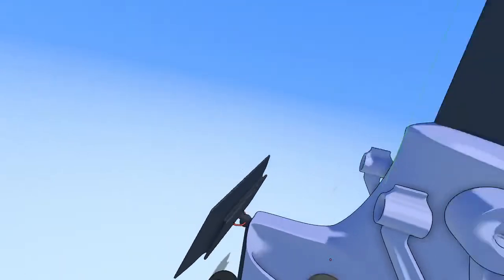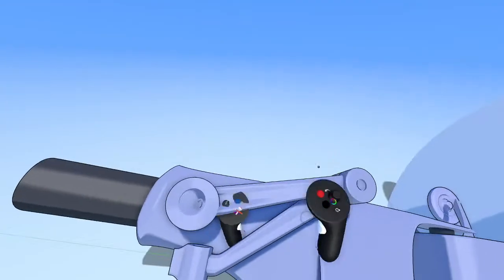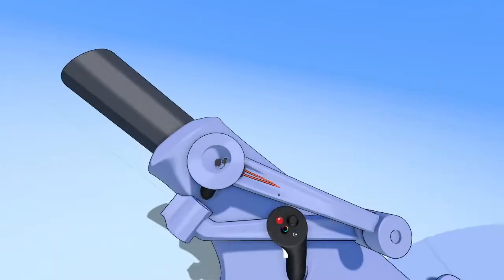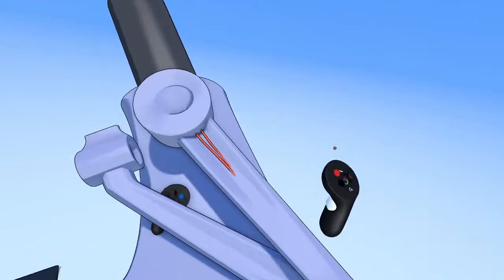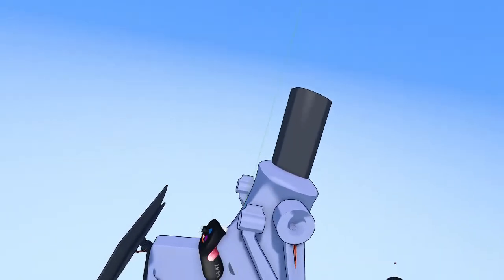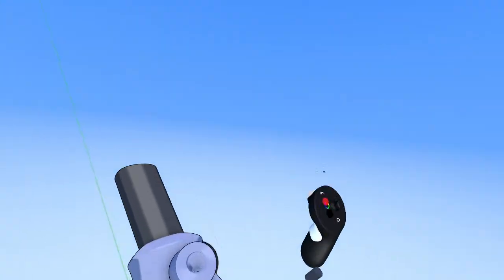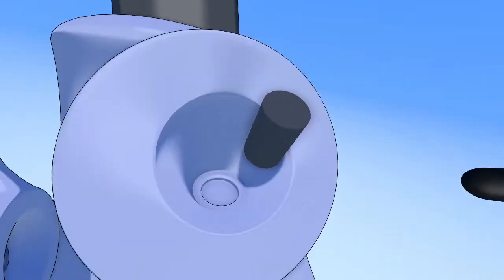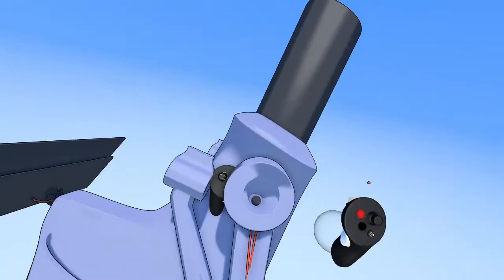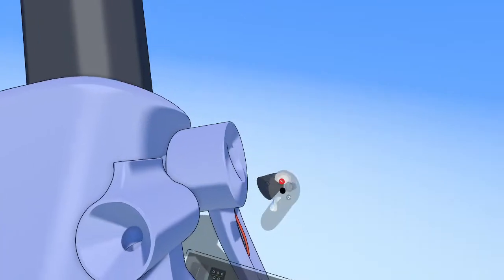Okay, and those little details like that just do a lot for a final render. We can even show some wires, maybe just surfacing a little bit there. We can duplicate the revolve shape we have here and make something that looks like a bolt in here. Maybe we'll do that here as well.